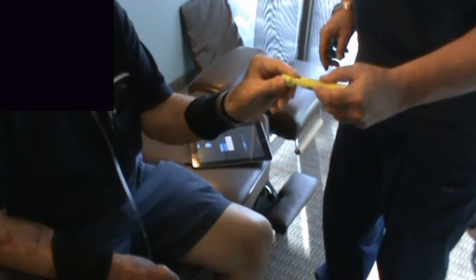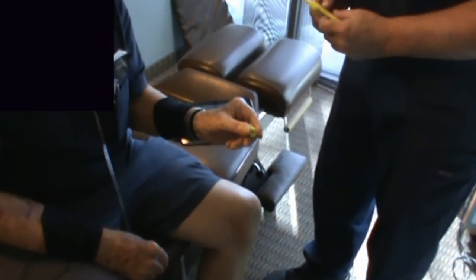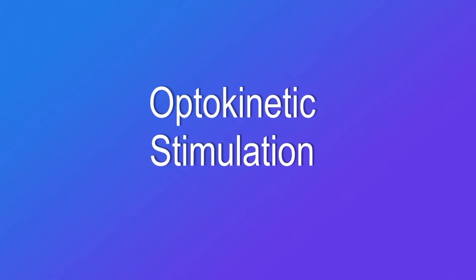Turn it down to the lower tone again. Let's try with that left hand again. Left hand? Yeah. So the lower tone seems to really help the left hand out. Would you agree? No. Okay.